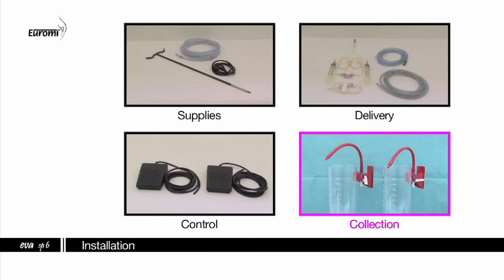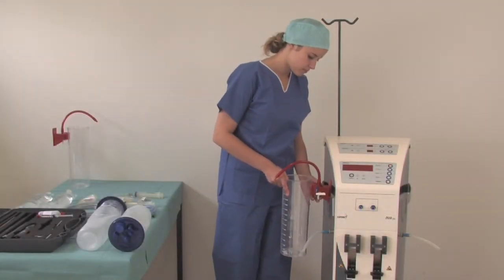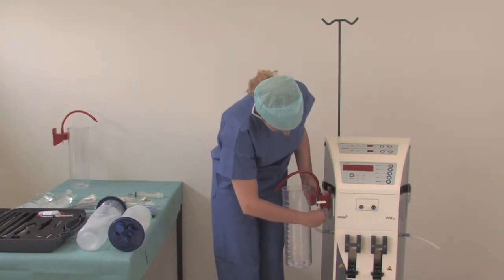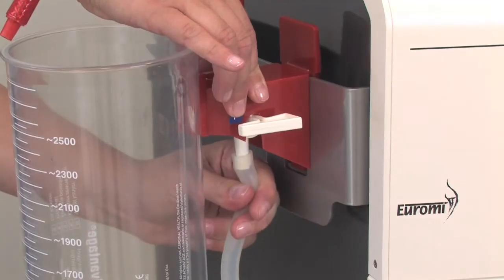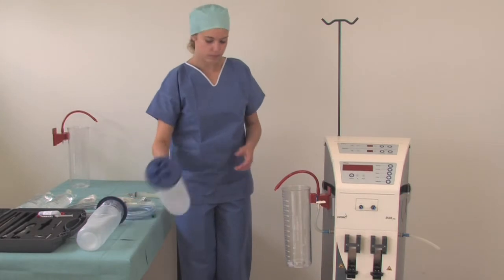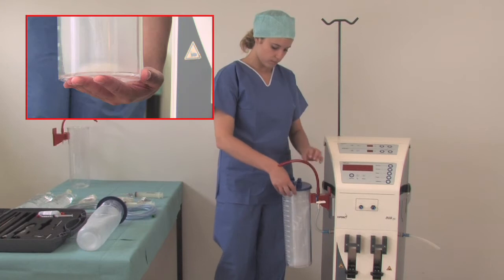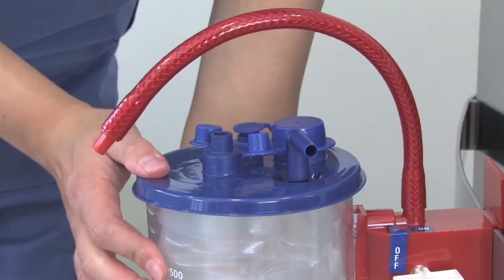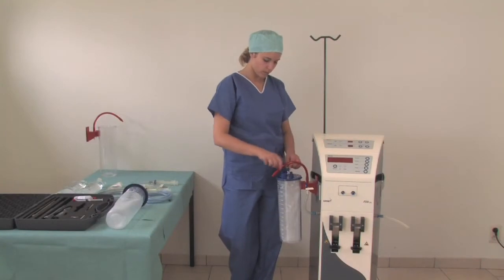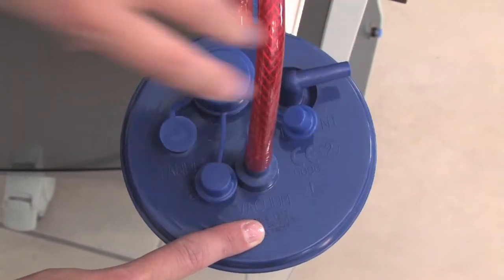Collection accessories assembling. Place the collection jar on the side rail of the EVA SP6. Connect the silicone tube to the white conical connector under the canister stand. Place the canister inside the jar. Snap the canister lid on the jar by supporting it from the bottom. Connect the red tube to the central nozzle of the lid. Repeat the operation for the second canister.